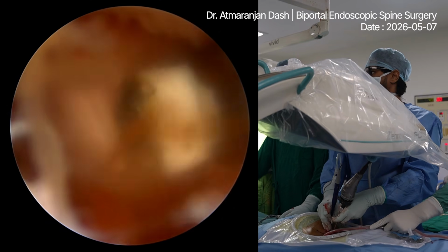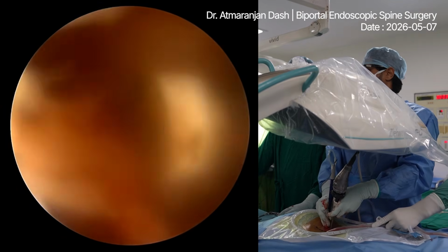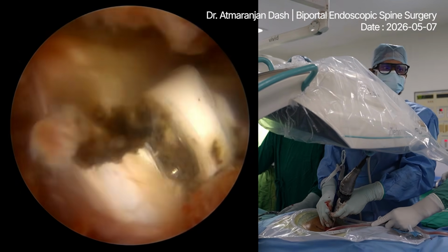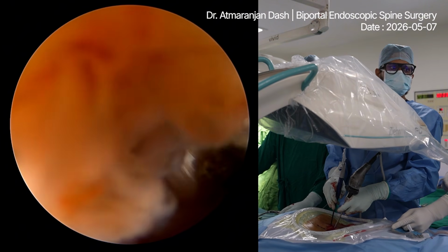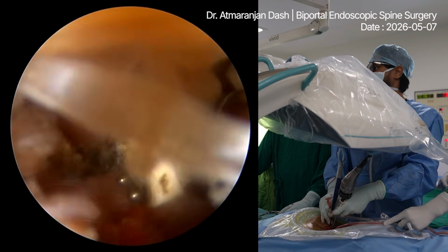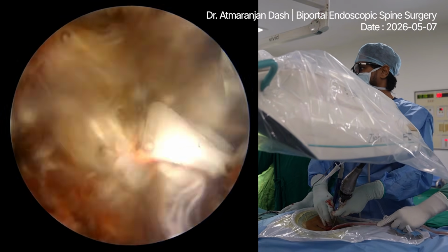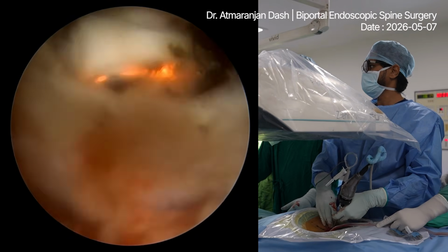Coagulation. Take a shoot and take out the C-arm. Naturally, this was an operated case, so some degree of scarring you will definitely see. Shoot. Okay, so we are exactly on the TP. Take out the ablate. So you can see these are the scar tissues of the previous surgery.